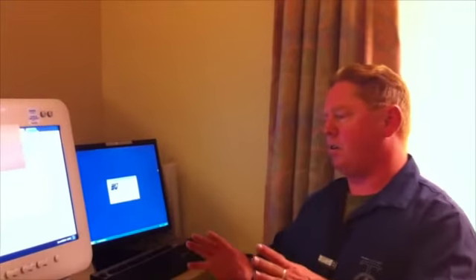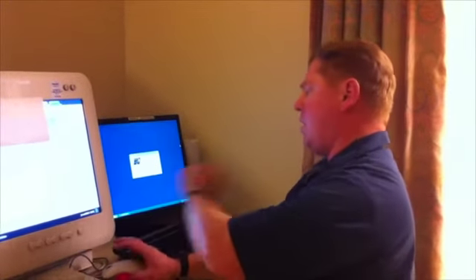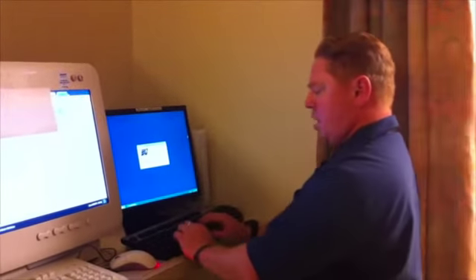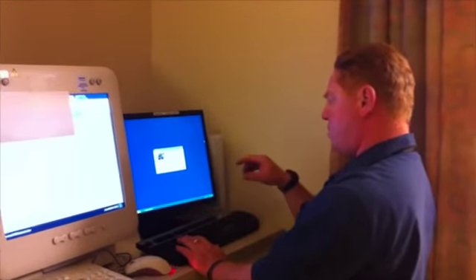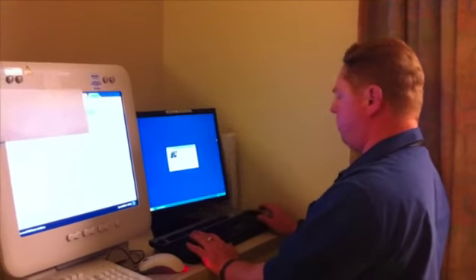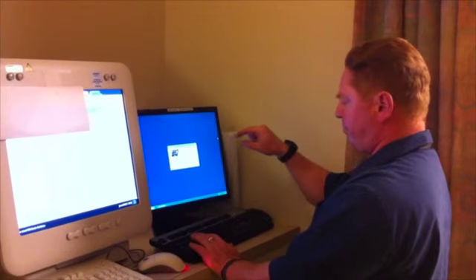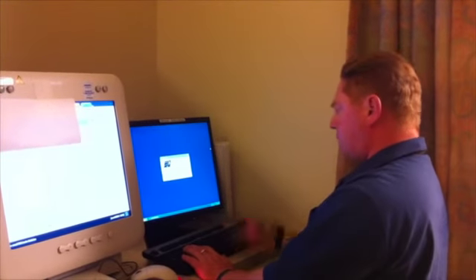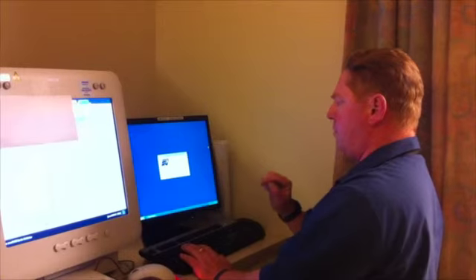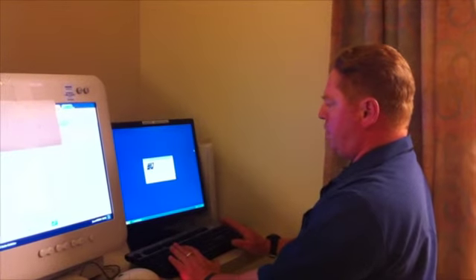All right. Once I've completed the exam, I go here, and down in here it says complete exam. I hit that, make sure it says complete, exit out. Then from there, I'm going to log in, find that same name, open it up, go to the DICOM icon, and hit DICOM. Then once it comes up, I know that it's been imported over. I'm going to view it, make sure it's all okay. I don't need any cropping or anything like that.